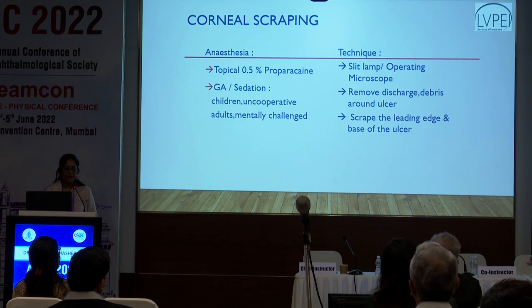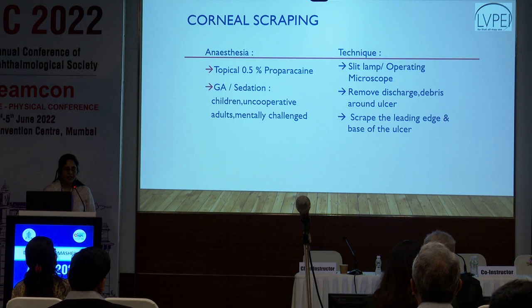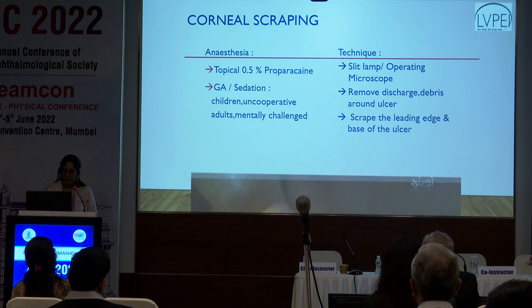And sometimes we even have to do it under sedation or general anesthesia for children. Otherwise, you can do it at the slit lamp or make the patient lie down. And if you have an operating microscope, just use that for scraping the eye. You can put a speculum, and make sure it doesn't get contaminated by discharge or debris, and keep the lashes away.